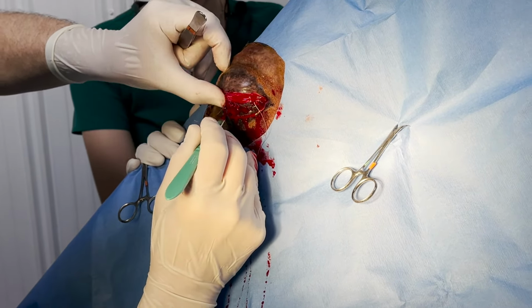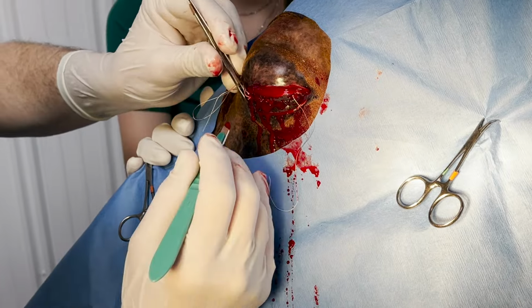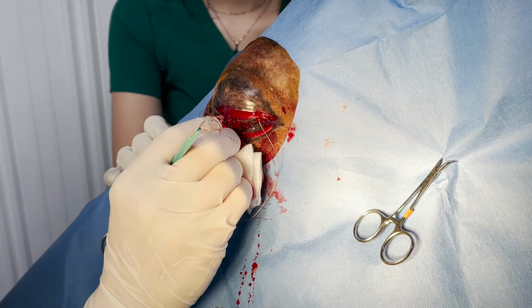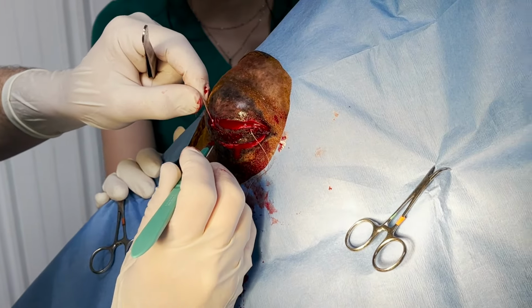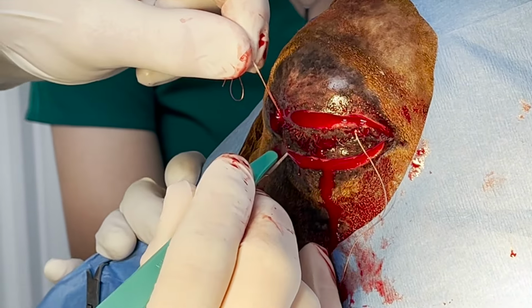As you can see, she's not reacting at all. She's got butorphanol on board. She's got Vute on board, sedation, and everything's numb. So anytime you can not do general anesthesia and get away from those risks, it's ideal. And the standing procedures have become common practice in the last decade or so.